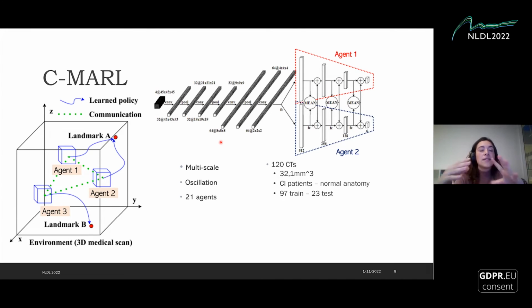This strongly resembles how humans, or doctors in this case, will interact with the 3D image, because first you will try to locate the inner ear within the full head CT scan, and then you can try to find the cochlea or the different nerves.